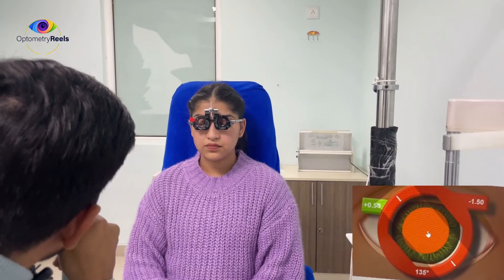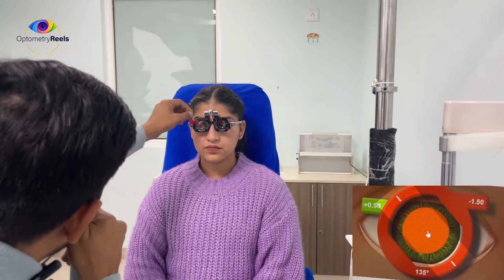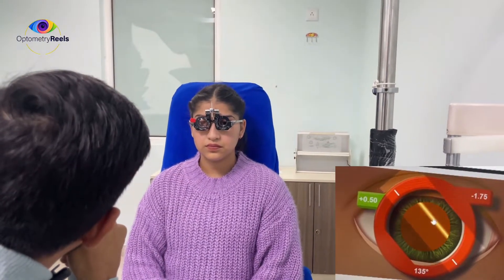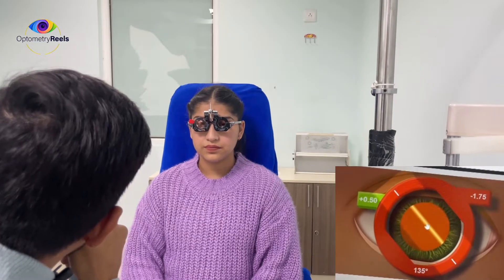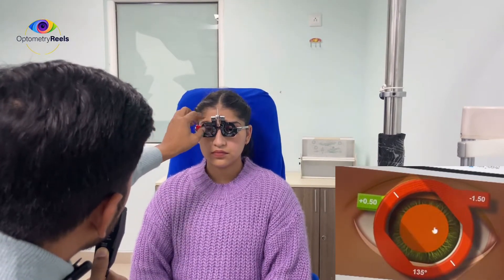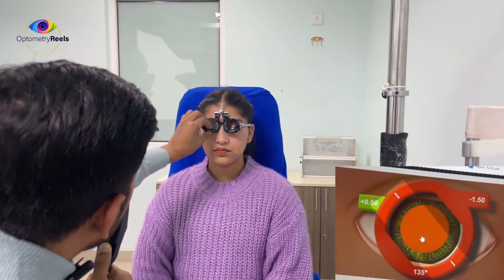So friends, with minus 1.5 cylinder it is appearing as a neutral glow to me. But I am going to confirm this by increasing the power further to 1.75 to see whether the against movement is becoming with movement or not. Now this is with movement, so it is confirmed that the earlier lens was the better lens — minus 1.5 is the neutral point for this meridian.